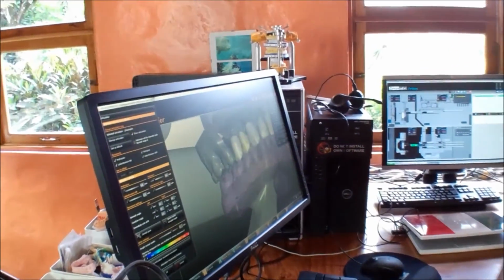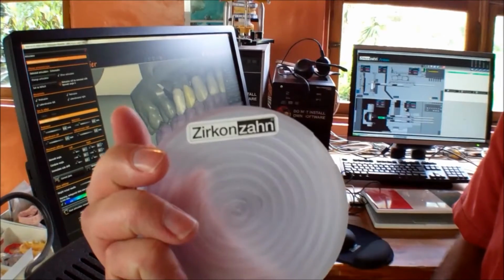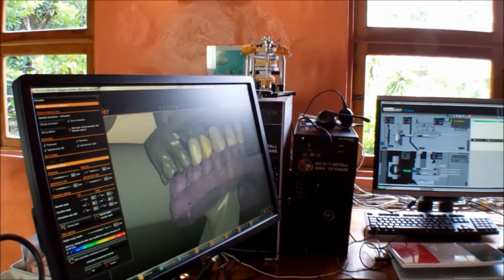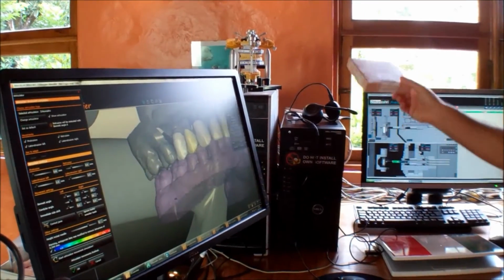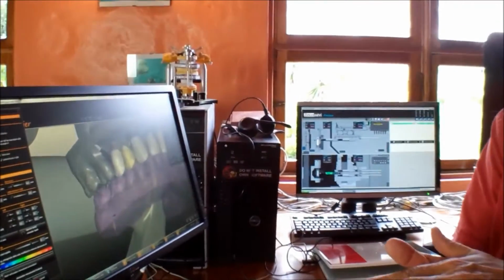This is the material, a very unique material. So in case the doctor can take an impression of you when we did the work, and then I do this one and send it to you. He doesn't even know that I'm doing this. This one is for me and my wife. But I'm waiting for the new shipment of the materials, and then I'll start to do it for clients, because then you're going to have your bite, and when you do your movement in the night, if you have this, you're not going to shock here. That's the most important.